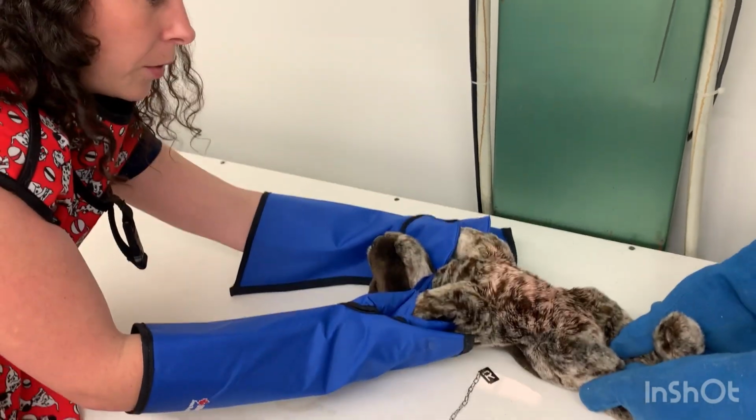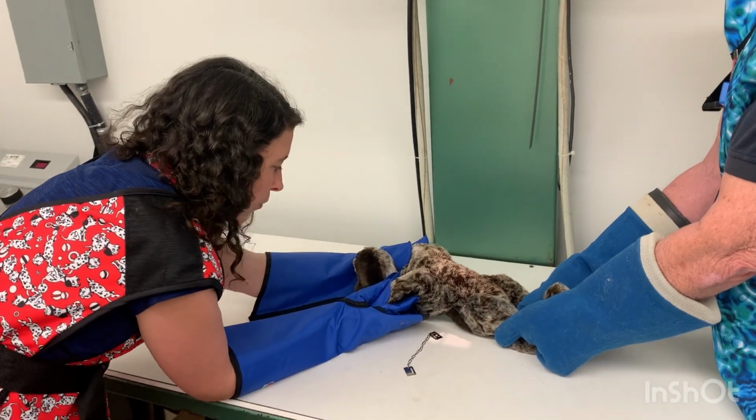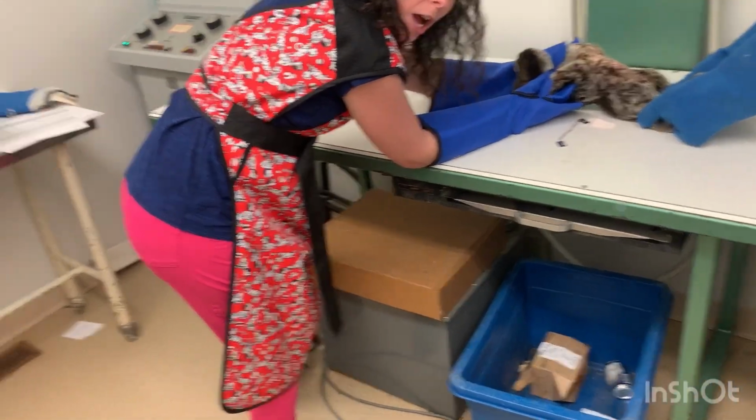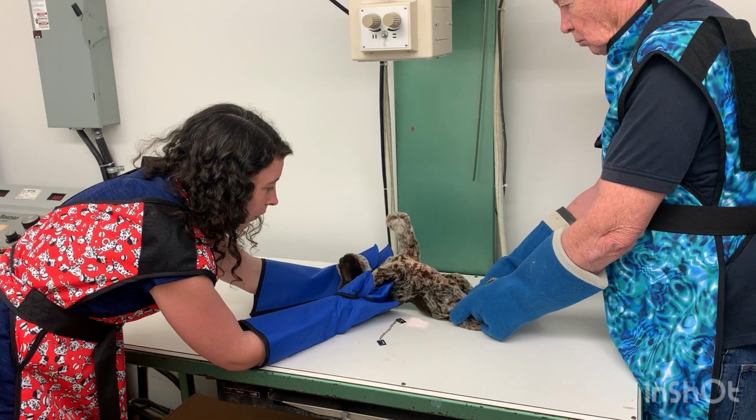So then we're in a good position here. I'm not changing our settings at all. I'd be pressing down on our foot pedal again, waiting a few seconds, and then fully pressing down to take the image. And then we would be all set there.